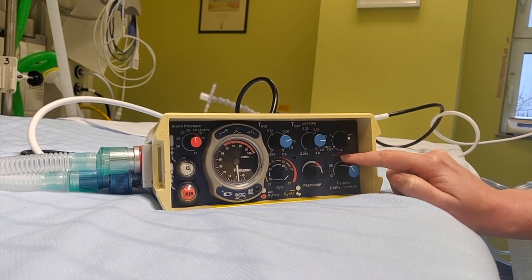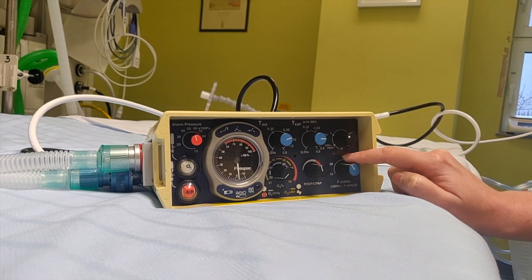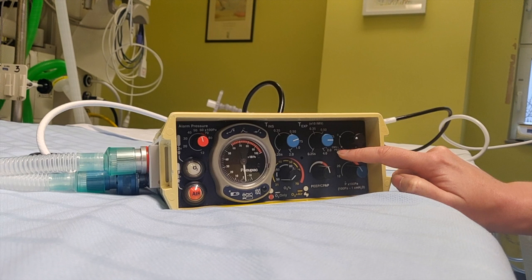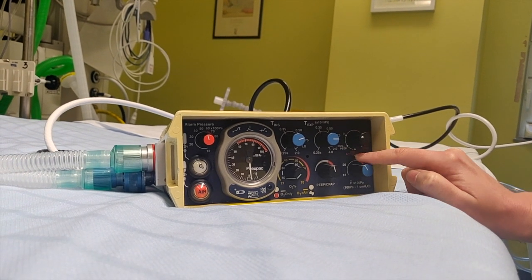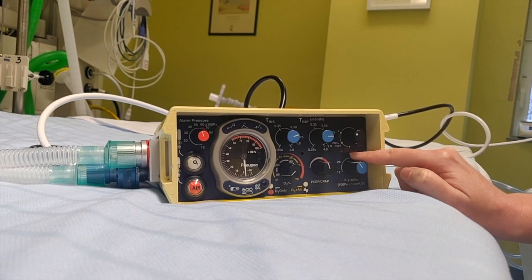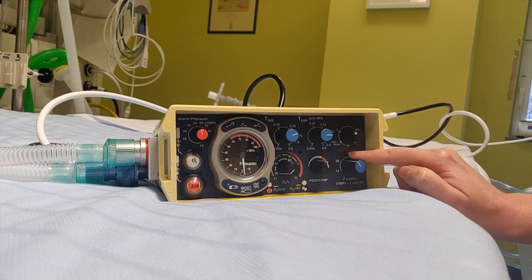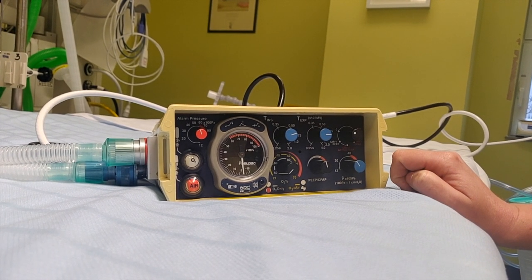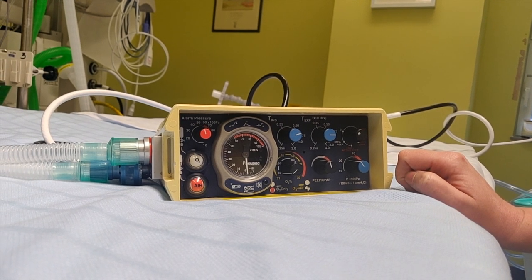In this context of the pandemic, where we are looking at how much gas we're using, I would advocate to use CMV plus PEEP as standard, and only use active PEEP if you have significant leaks that you cannot control — which ideally you wouldn't have in the patients we are planning on ventilating over the next months.